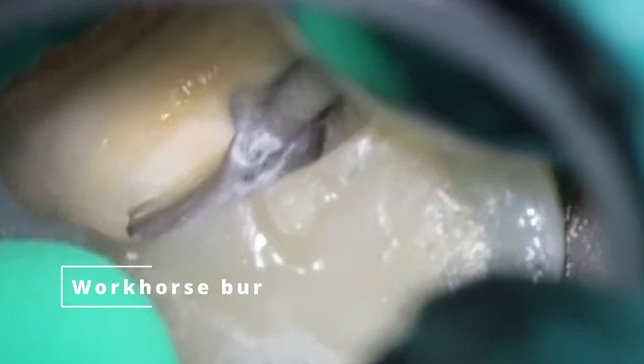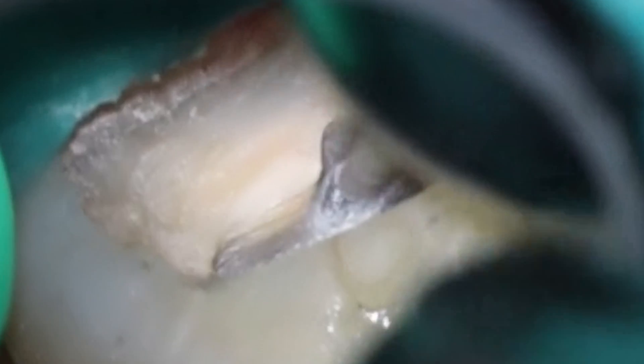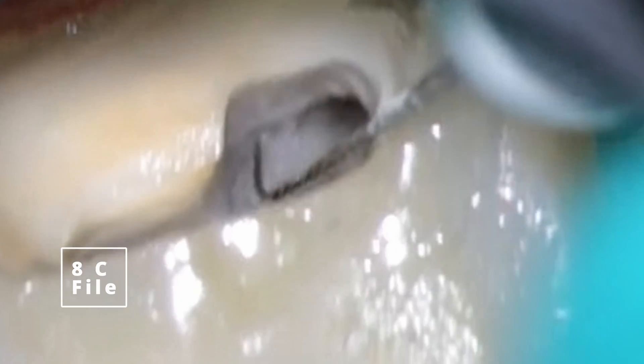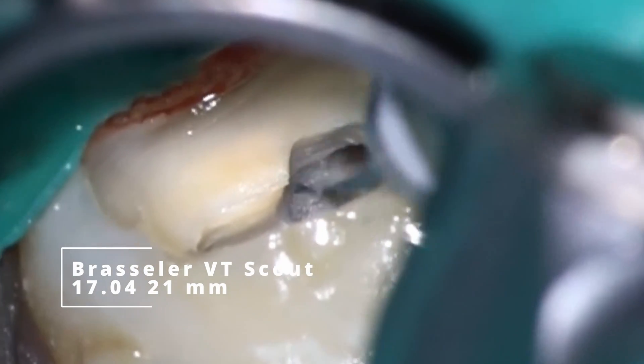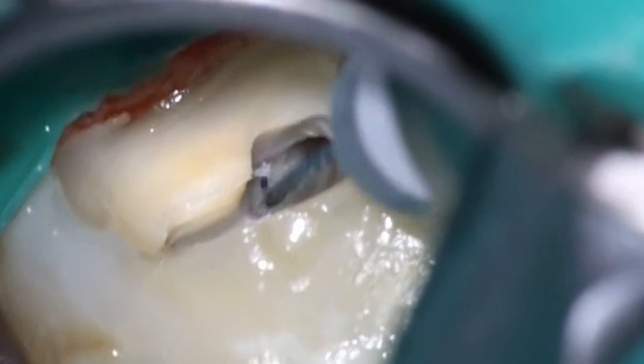Trying to poke around at the 8C didn't get anything there, so we're going to go a little bit farther with the workhorse. You'll notice that the little white dot is moving every time I move out — we're shaving maybe a tenth of a millimeter off each time — and it's starting to move both mesially and buccally. That's what you tend to see: these MB2s, where they start off is not where they're going to end up. Very gently going in there, going back in with the 8C file. I'll also sometimes try the 1704 or the 2006, just switch it up and see what will grab.